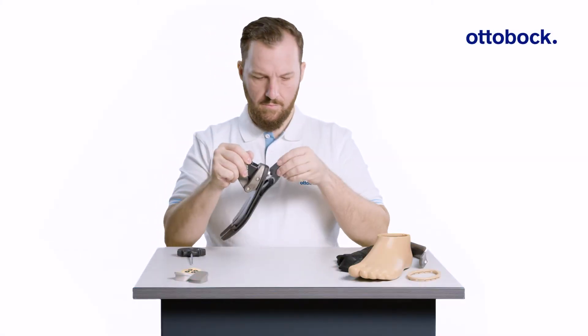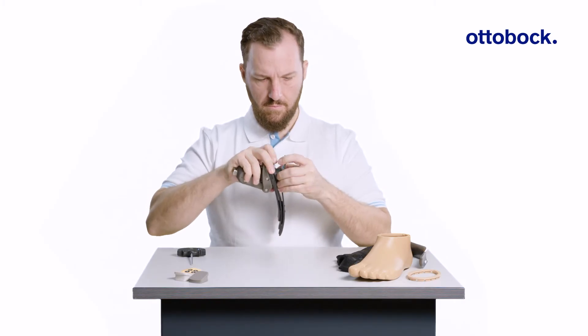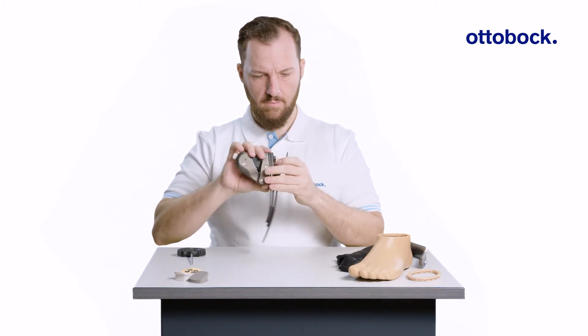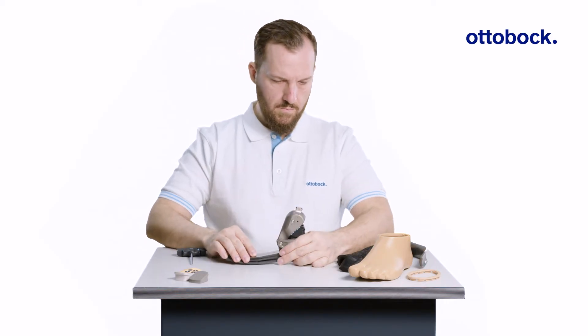The Taleo ADAPT is delivered with the black heel wedge pre-installed. Clinical experience shows that most users will prefer the firmest wedge due to the hydraulic motion of the Taleo ADAPT.